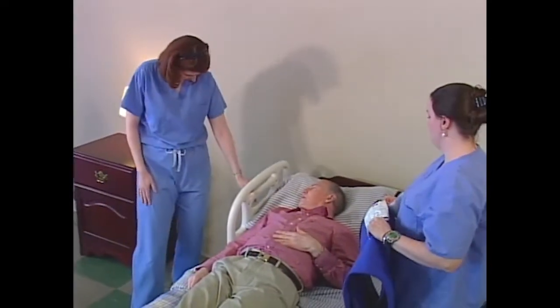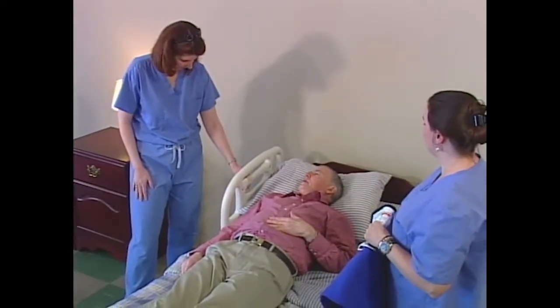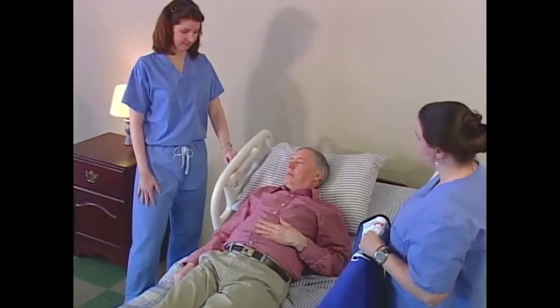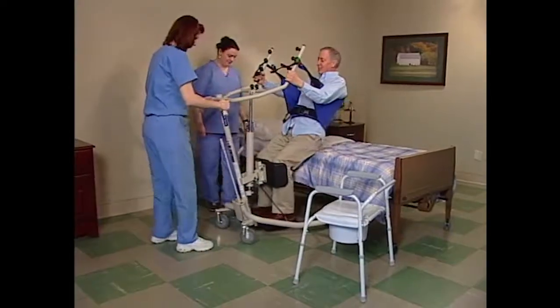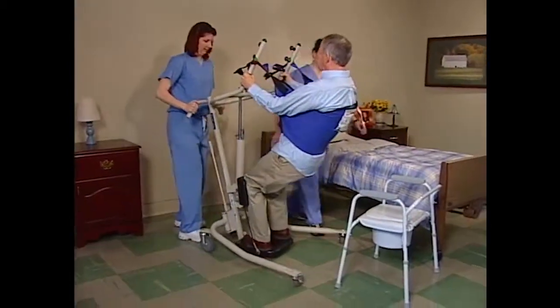It's a good idea to communicate with the resident throughout the process. Let them know about each step before you perform it so that the resident is comfortable, relaxed, and can help you in any way that they can. If you explain each step as you work through it, your resident will learn the routine and become comfortable with it.